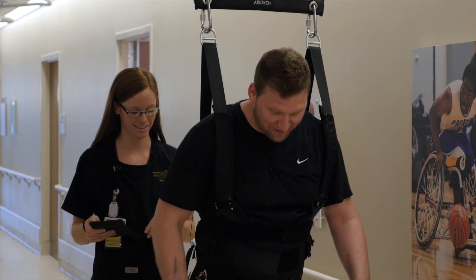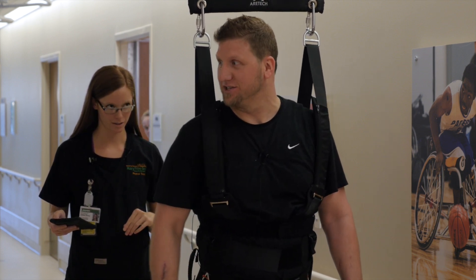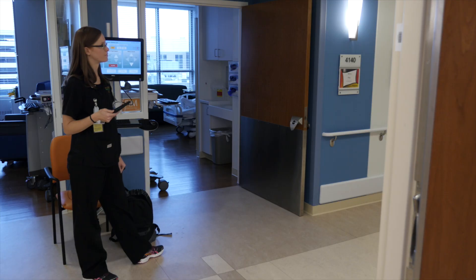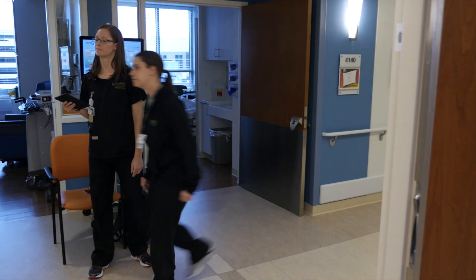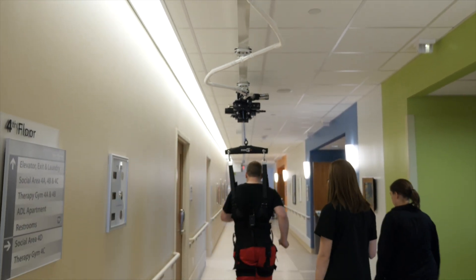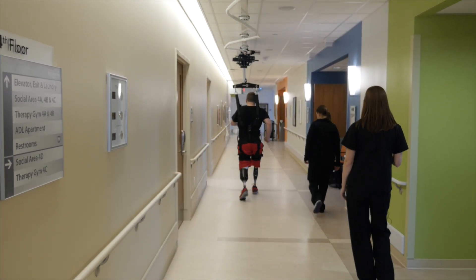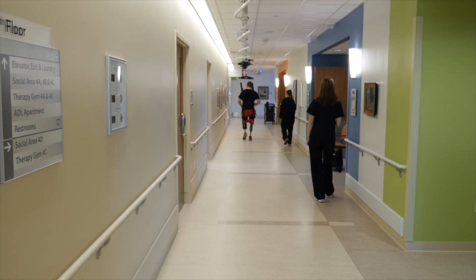That's weird — I think the knee locked in position and I couldn't bring it through. It kind of makes their job fun, and they're always shaking their head. I'd be on the BOSU ball or something like that, and they just say they haven't seen a bilateral amputee do that kind of stuff, so it kind of makes their job fun too.